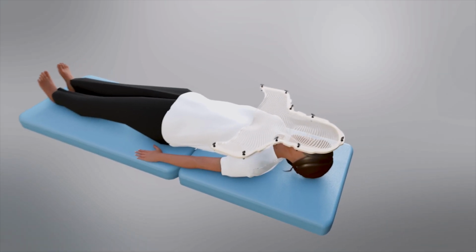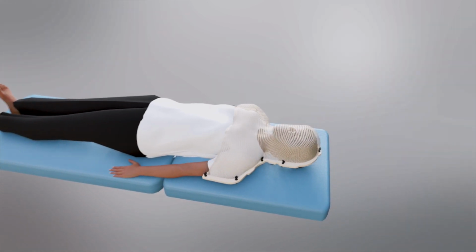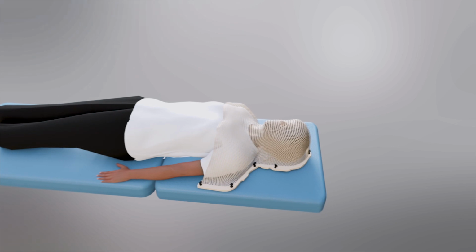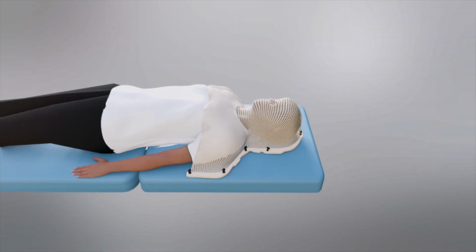A custom mesh of the patient's face, neck, and shoulders is created. This mask is used to keep the head and neck absolutely still in an identical manner each time a patient has radiation therapy while allowing the patient to breathe easily.